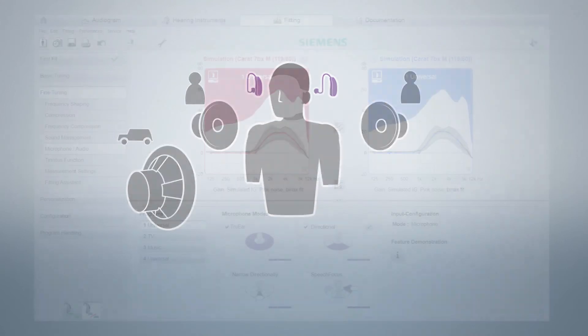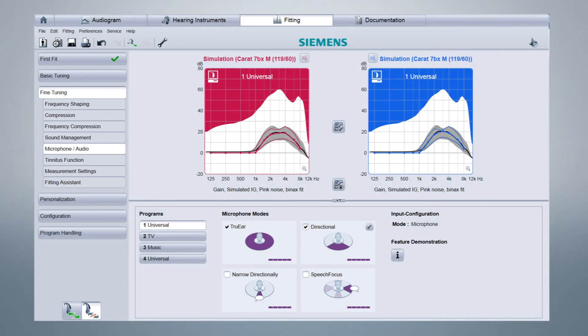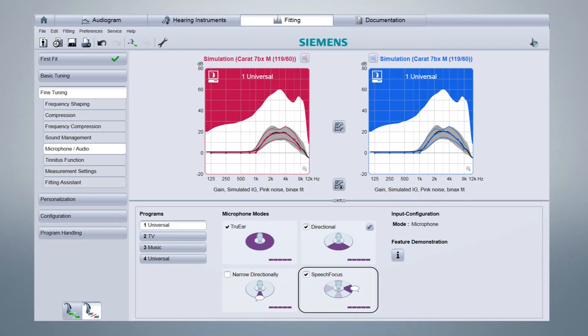Here you see in the Connex software how the simulation was performed. We will compare a directional microphone setting, which is what conventional hearing instruments switch to when they recognize a car situation simply as a noisy situation, to spatial speech focus.